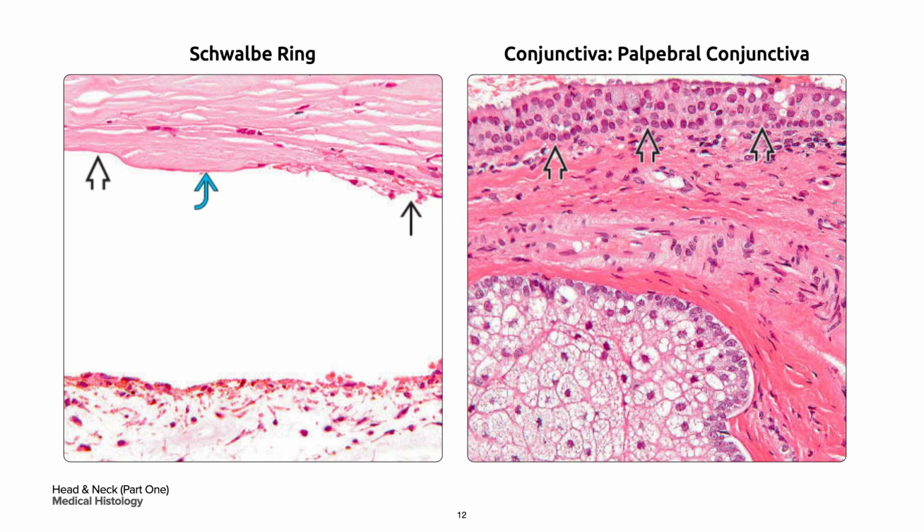On your right is the conjunctiva, which is, in the bold black arrow, the thin transparent lining covering the inner surface of the eyelid, which is the palpebral conjunctiva, and reflected onto the anterior surface of the globe, which is the bulbar conjunctiva. Its function is to allow the eyelid to slide smoothly over the globe.